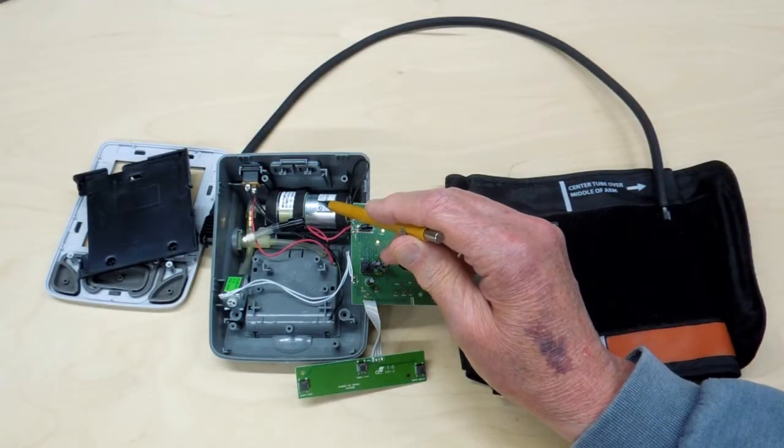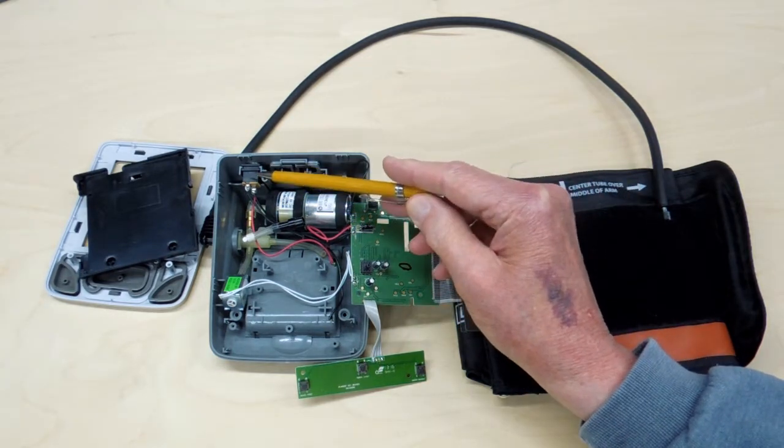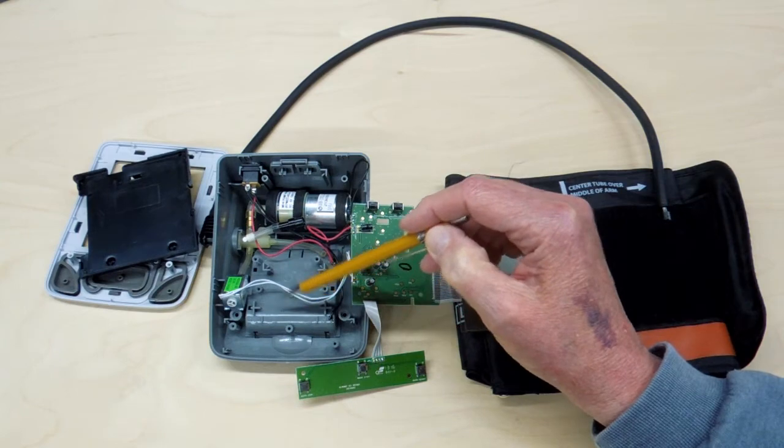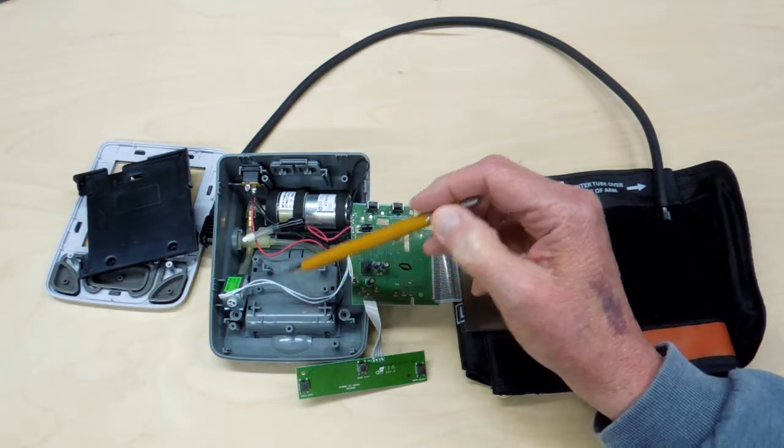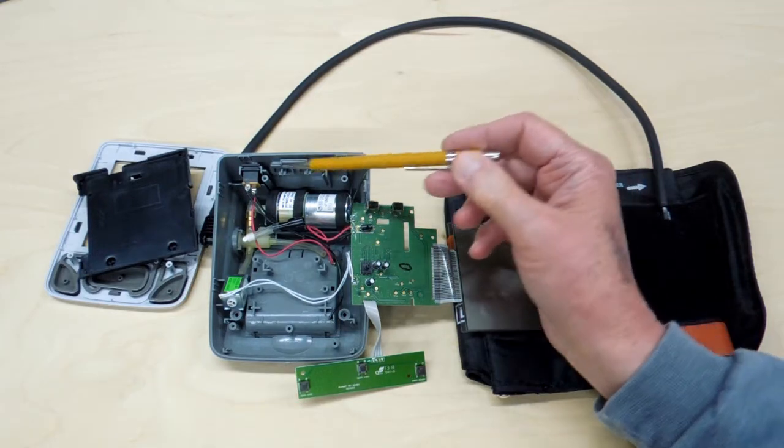There's a 6-volt DC motor running a little air pump. It'll run off of a 6-volt power supply or four AA batteries. Those batteries won't last terribly long in one of these, so it's cheaper to have the power supply.